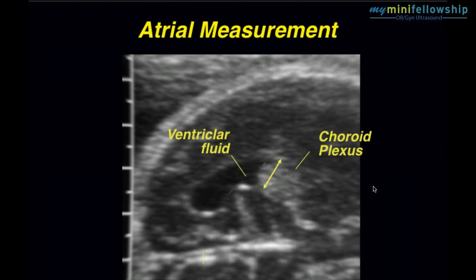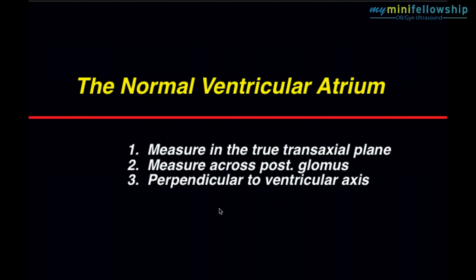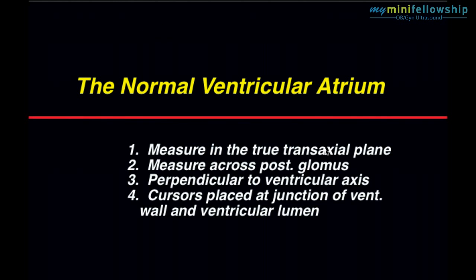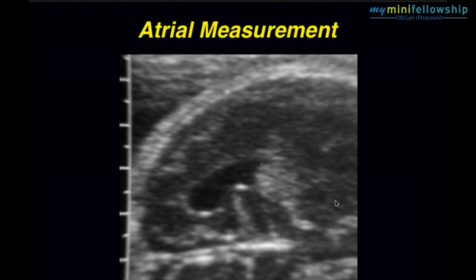We want to measure across the distal glomus. We want to measure perpendicular to the ventricular axis. That means we must determine the ventricular axis and measure perpendicular to it. We do not want to measure perpendicular to the midline, as is the case with certain other ventricular measures. Finally, we want to place the cursors at the junction of the ventricular wall and the ventricular lumen. To put this simply, we want to measure the shortest distance across the ventricular lumen at the ventricular atrium.